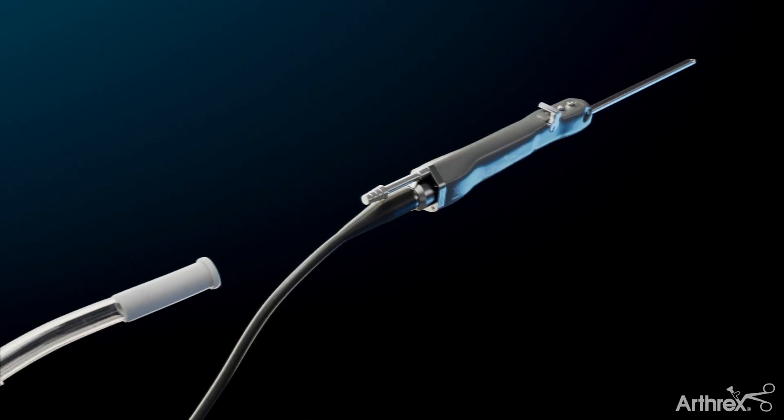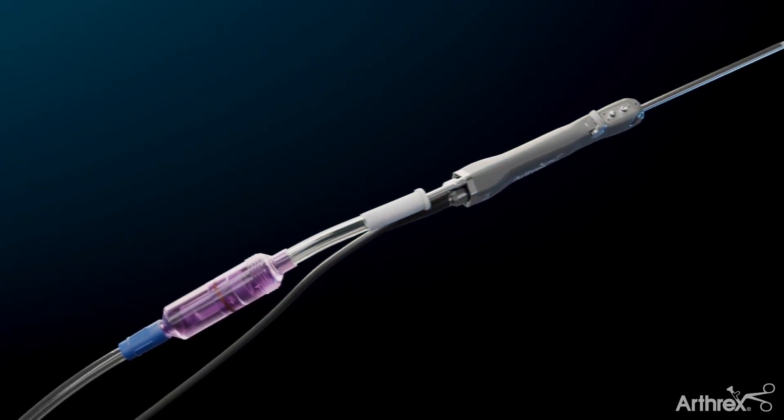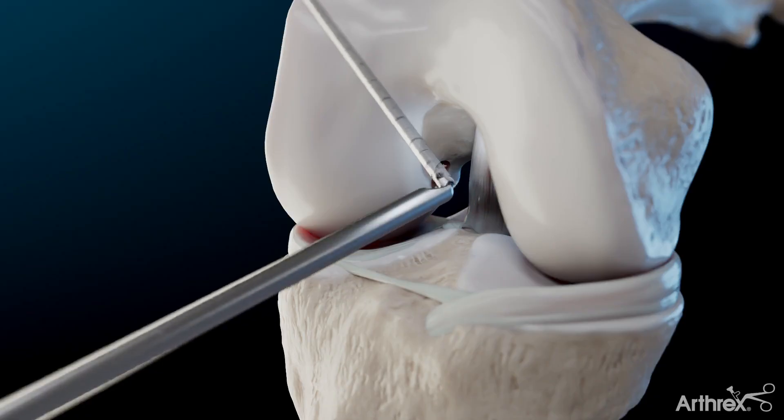Prepare for autologous bone collection by connecting the GrafNet device to suction and an arthroscopic shaver. Identify the desired femoral tunnel location and advance the FlipCutter 3 reamer. Introduce the arthroscopic shaver with the GrafNet tissue collector attached into the joint and ream the femoral socket while collecting bone debris.